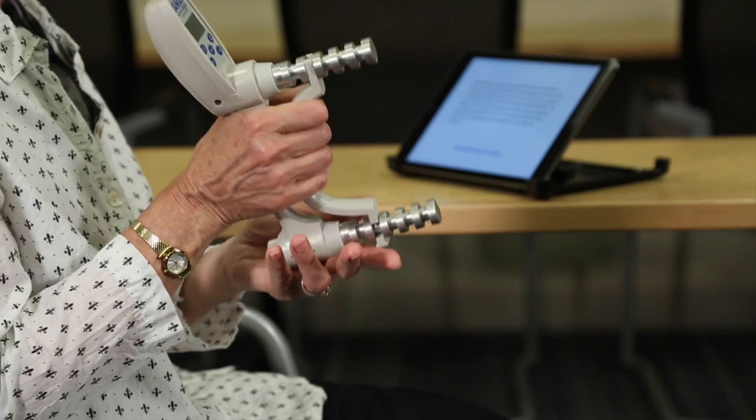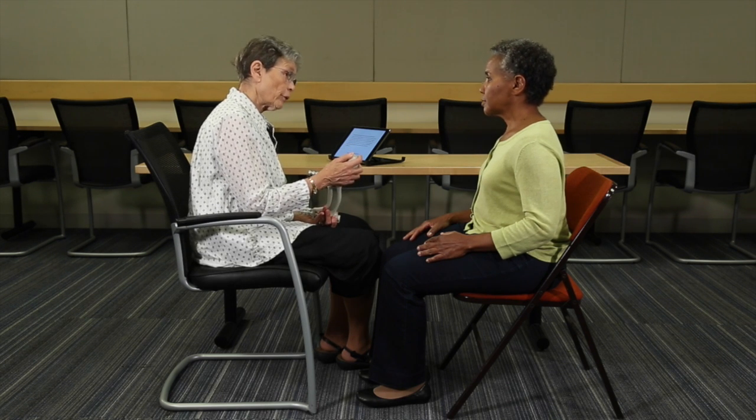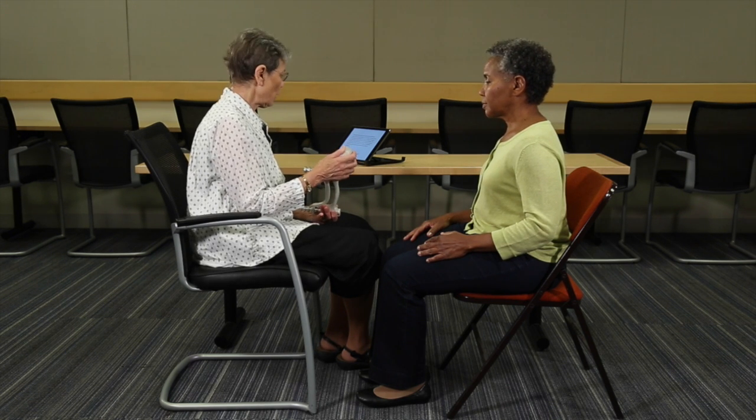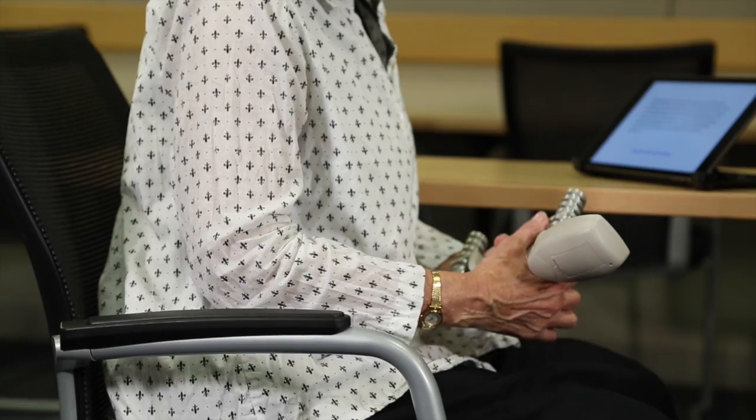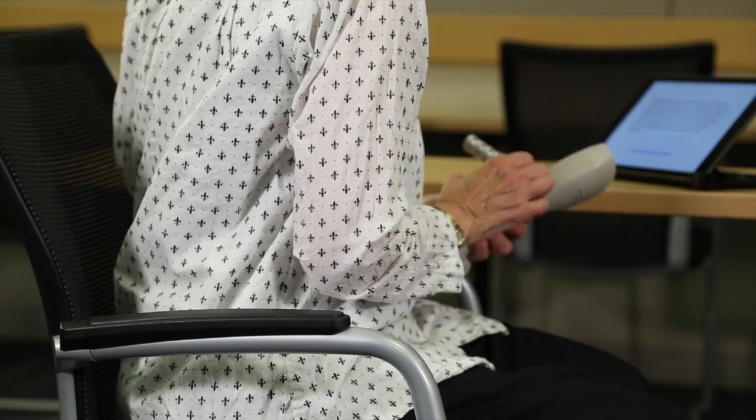We will use this machine to measure how strong your hands are. You will squeeze the handle 2 times, one practice and one test trial with each hand, while your arm is close to, but not against your side, and bent at a 90-degree angle. The handle won't move, but the machine will show how hard you squeezed. Do you have any questions?